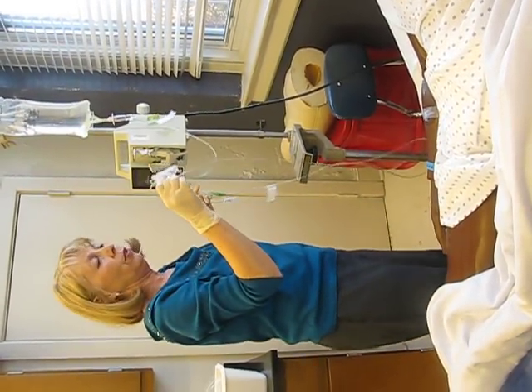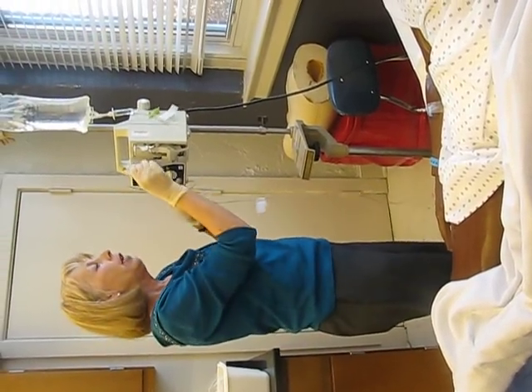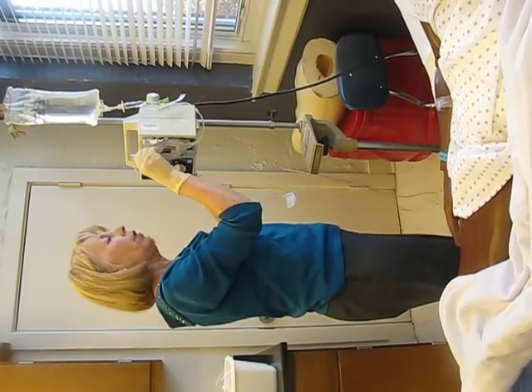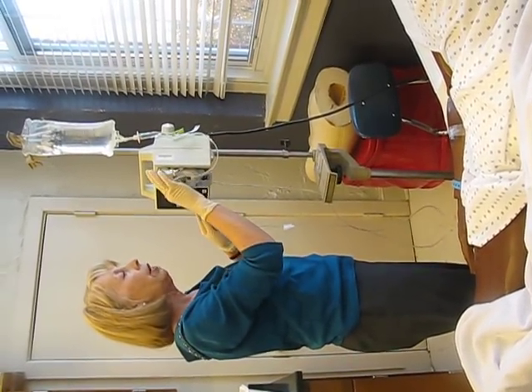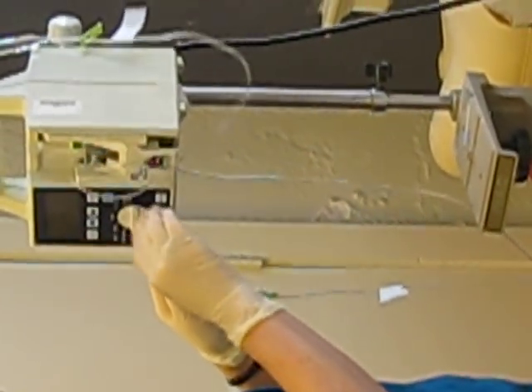Let's go ahead and put it in here — it's just easier this way. You take it by the handle. Find the little groove right here. Sometimes that's easy to do and sometimes it's not — better practice it a little bit. There's a little groove there, and then you can slide the clamp down and close up the system.